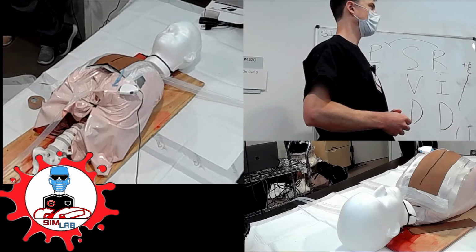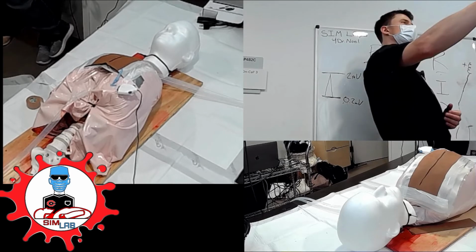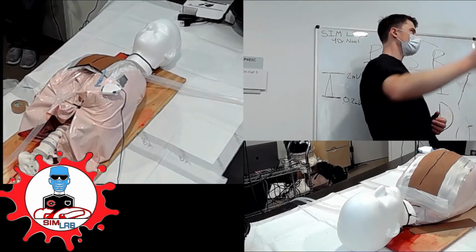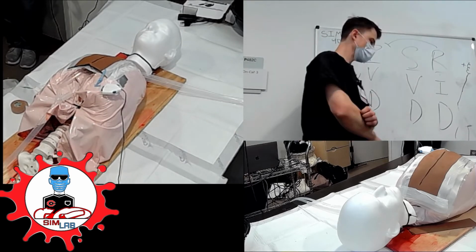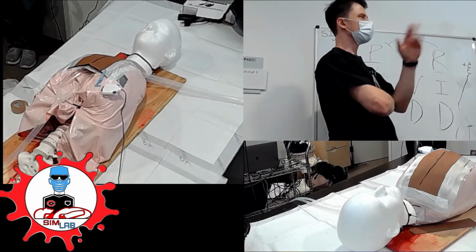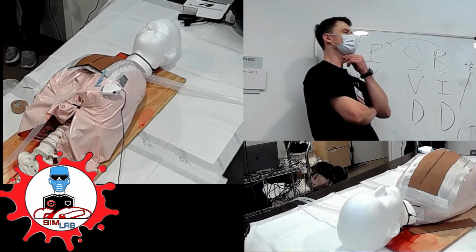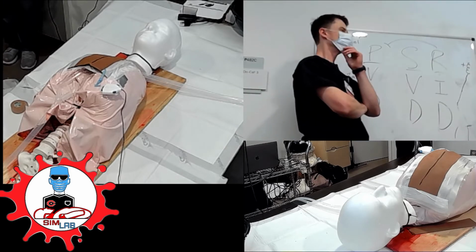Cool. All right, so let's say you're up post-op day 2 on this patient, and you want to check what the underlying rhythm is. How are you going to do that? Just turn down the voltage. Okay, you turn down the voltage, you lose capture, you never get it back. There's a pause button. Okay, pause it, you never get the rhythm back. Turn the rate down until.